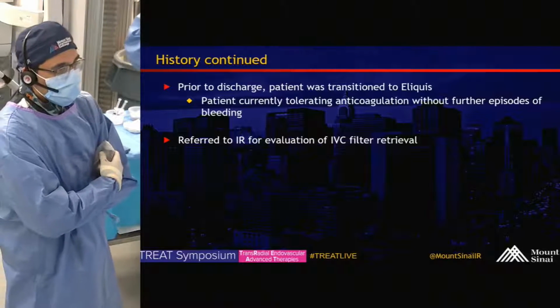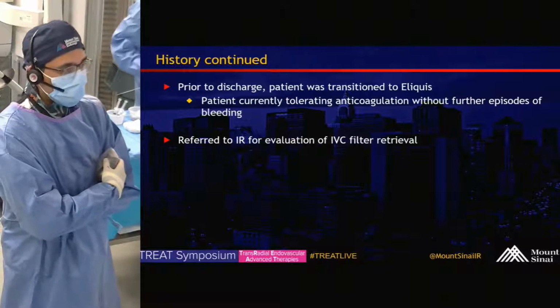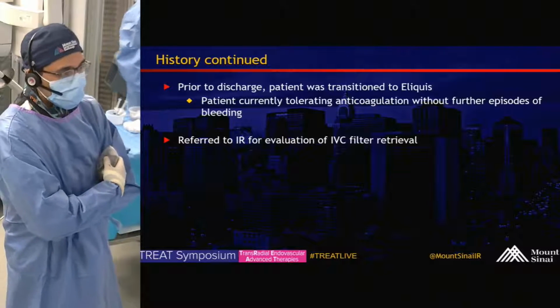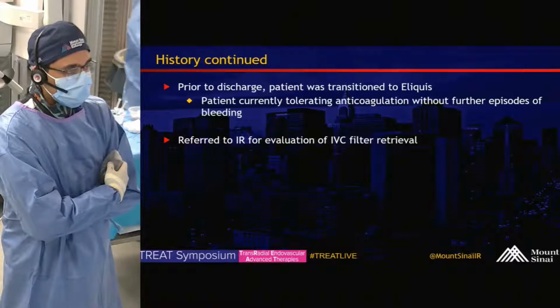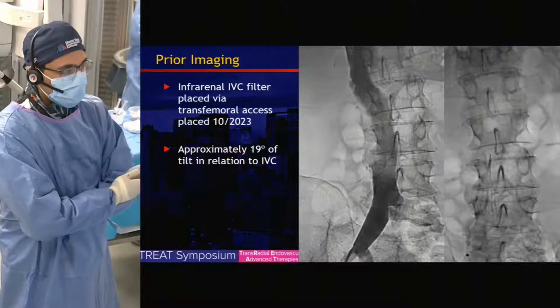Prior to discharge, patient would then transition to Eliquis. Currently, he's tolerating anticoagulation without any further episodes of bleeding, so he was referred to us for evaluation of IVC filter retrieval. Just this straight up, right?